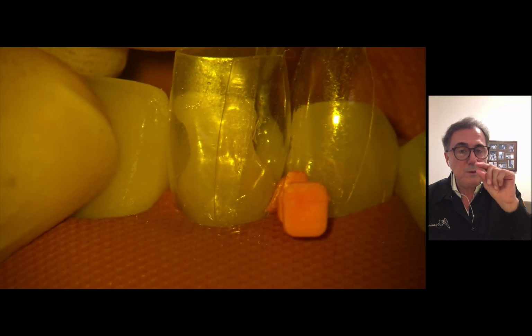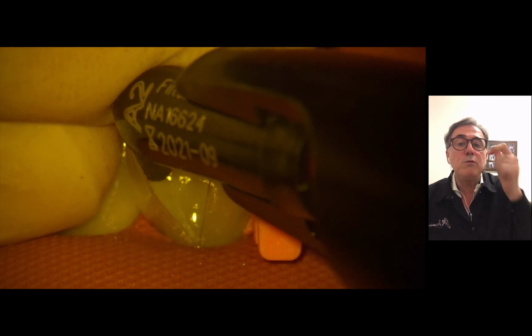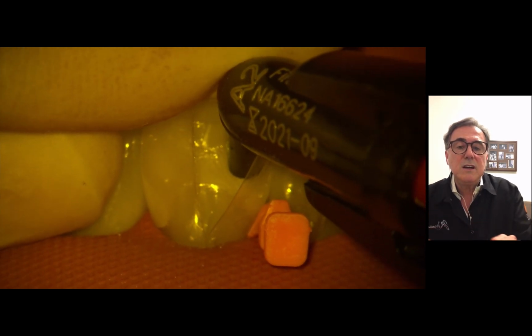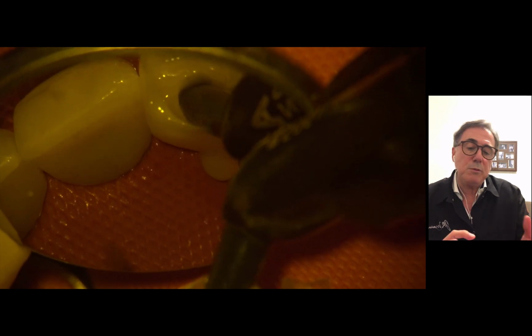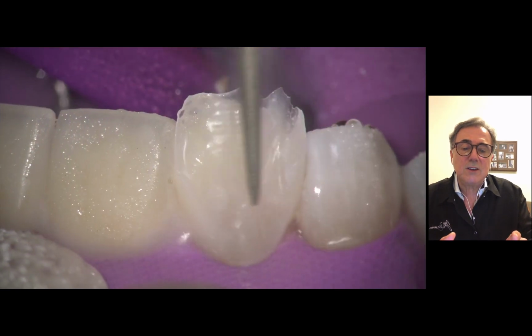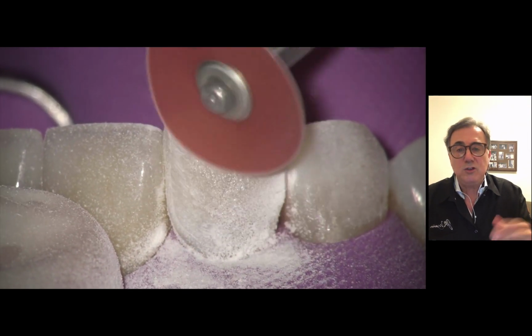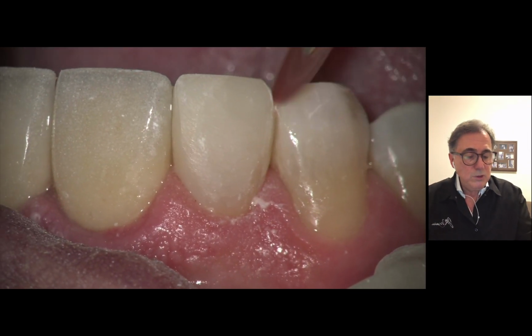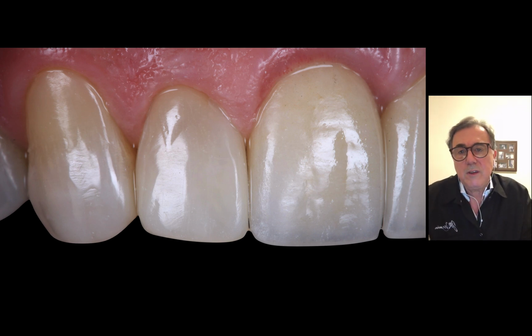And then before putting the flowable, as you see there, we put a little bit of adhesive again, and then you put the heated flowable, heated composite, everything at once, and then you adapt everything, from the lingual, from the buccal, and then you polymerize it, okay? Remove excesses and do your finishing and polishing as usual. And the final result is this one here, okay? One shade, just one shade of composite. That's it. And those are the results that we got, which I think are pretty good.